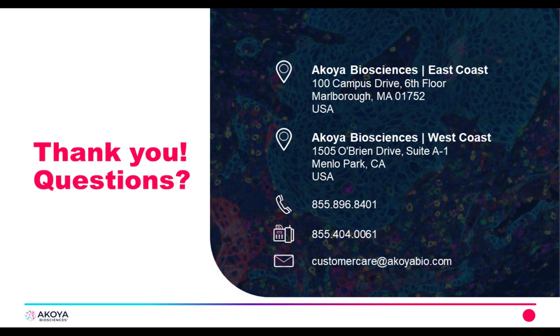We have some great questions coming in. What fluorescent channels are available, and will this be increased? That's another good question. The fluorescence channels that we're going to be using are DAPI, 488, ATTO 550, Cy5, and for FFPE, the Alexa Fluor 750 channel. I don't have any information about whether or not that will be increased at this time.